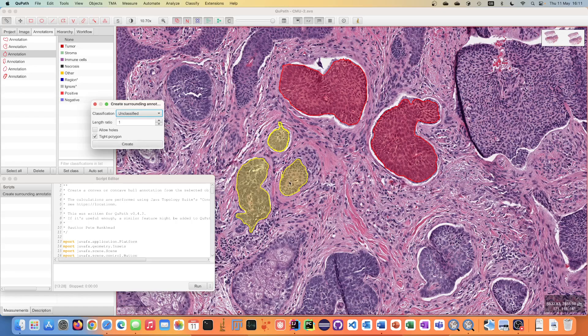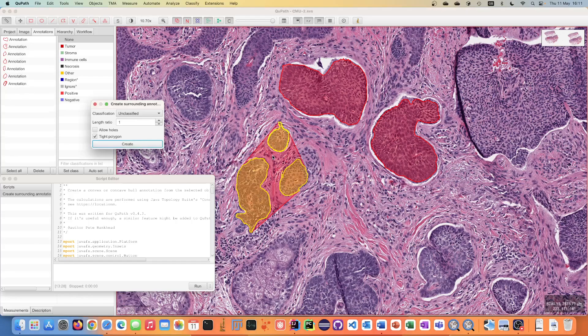So here I have three different objects. I've selected them, I run the script and you can see that it generates this annotation.